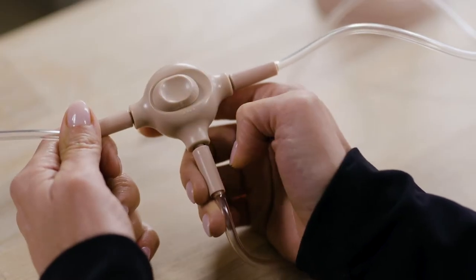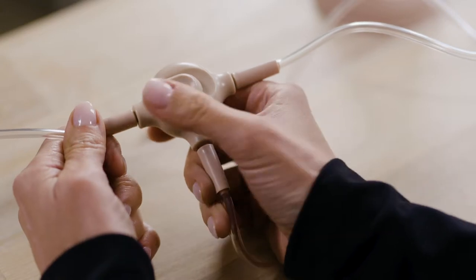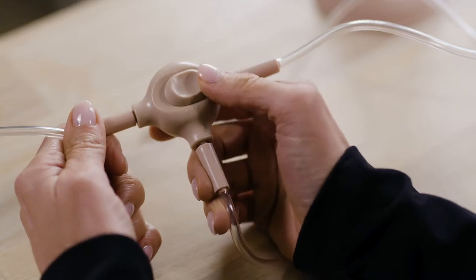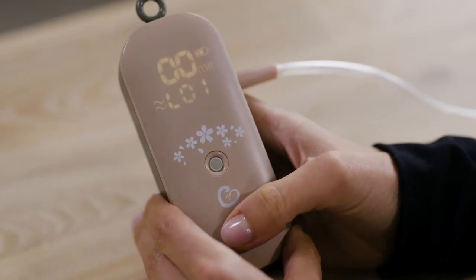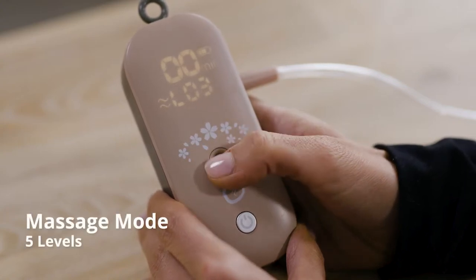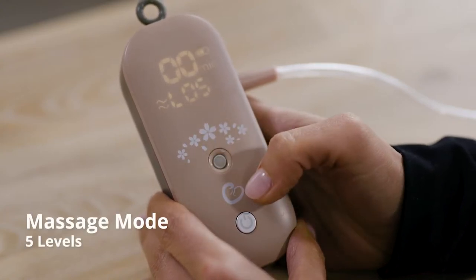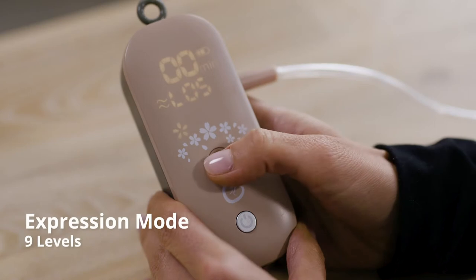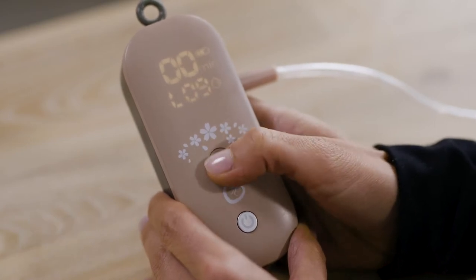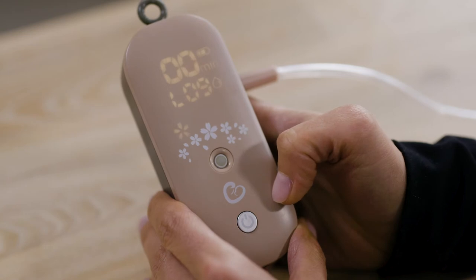To decide which side to operate, slide the key to select the side you will use — the left, right, or the centre for both pumps. Turn on the motor by pressing the power button. Use the track ball to switch from massage mode with five levels or expression mode with nine levels to personalise your pumping experience. Press to switch modes, scroll to adjust the levels.